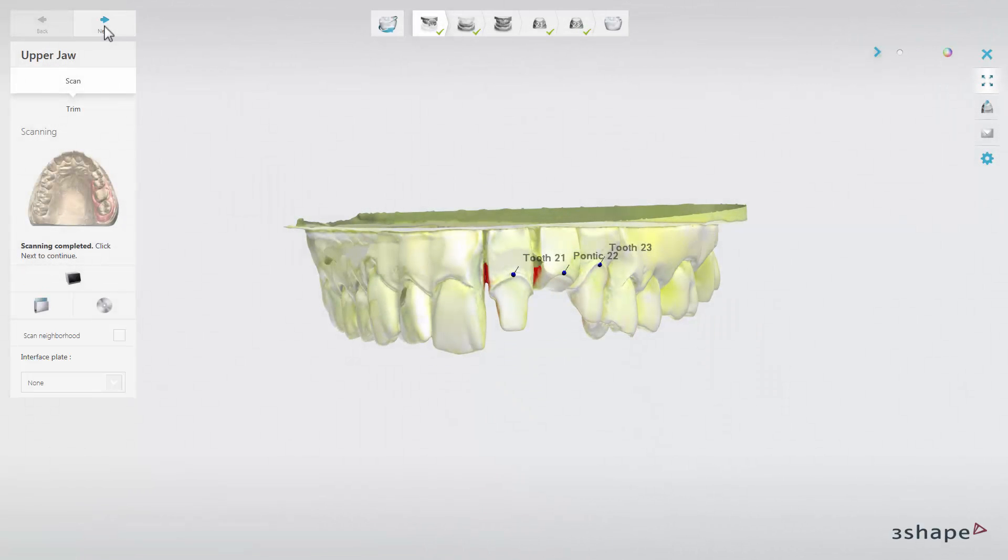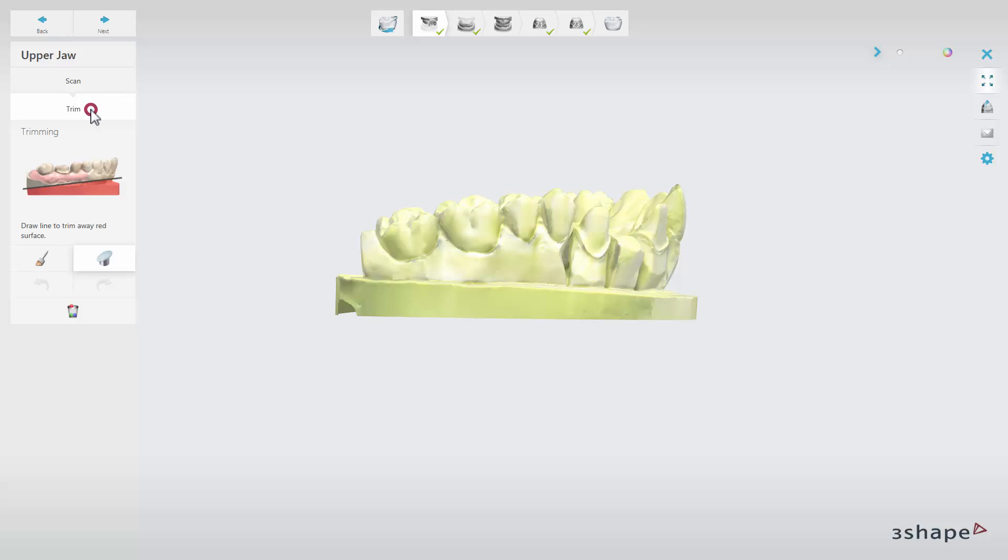All scans can always be trimmed using the Trim sub-step. Use a brush or cutting plane to trim the scan.